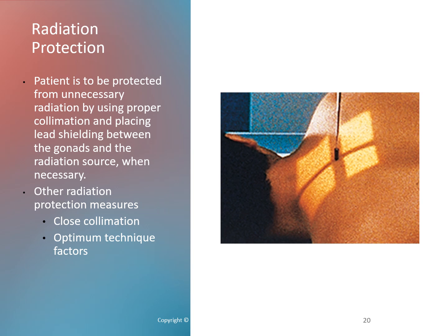Optimal technique factors: you should select a recommended technique according to the APR, if you have reliable APR software. APR stands for Anatomically Programmed Radiography. That's a registry question. You should have a manual technique for all these projections. As you watch technologists do ribs and sternum, you are going to find that they use AEC for the ribs, possibly AEC for the PA sternum. AEC is probably not available for lateral sternum. That's probably going to be a manual technique. You can look up technique guidance in Merrill's Atlas. They'll have representative techniques there.